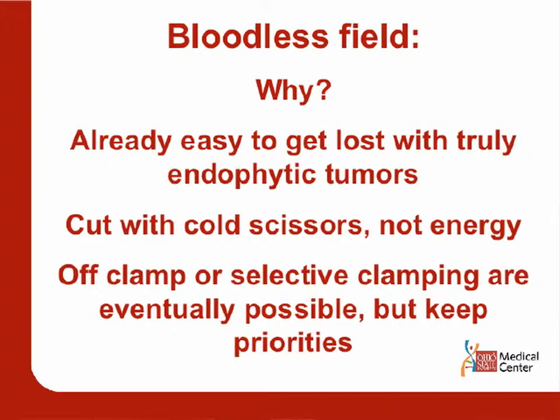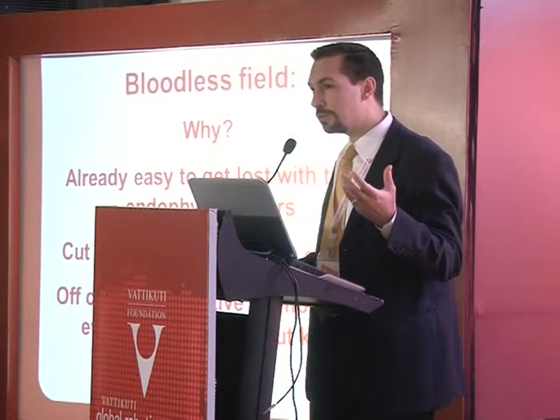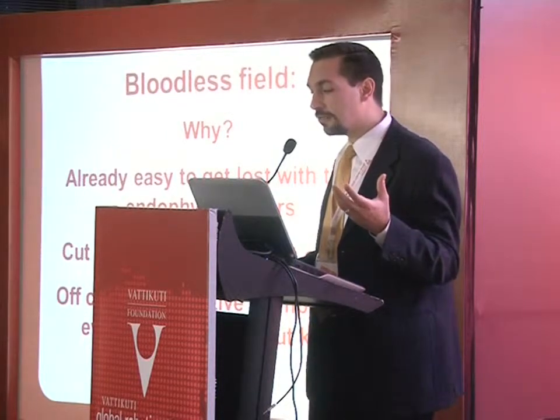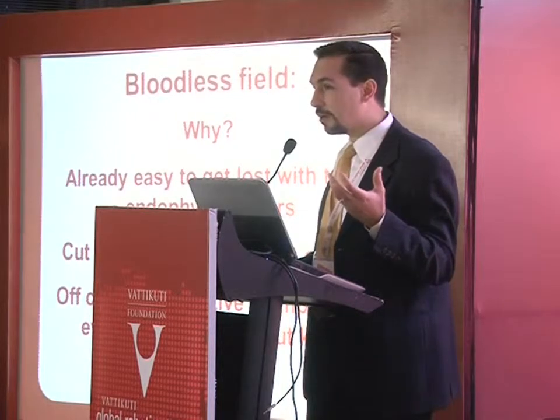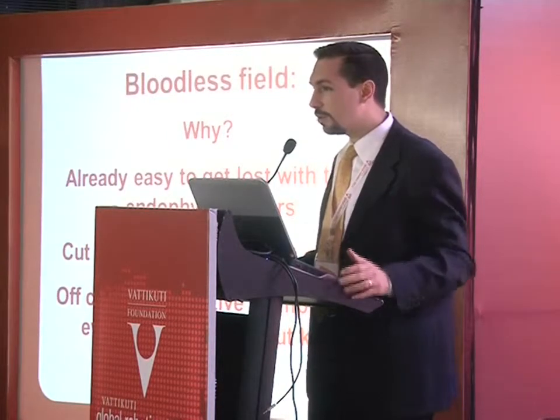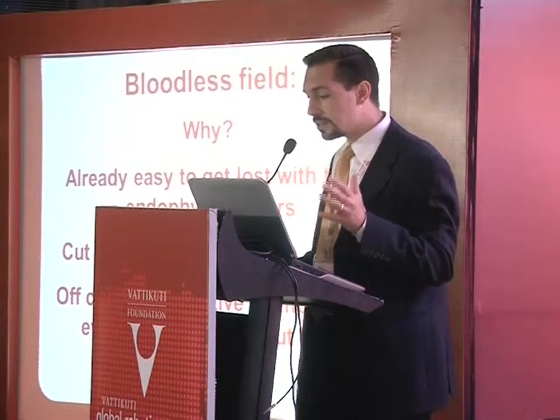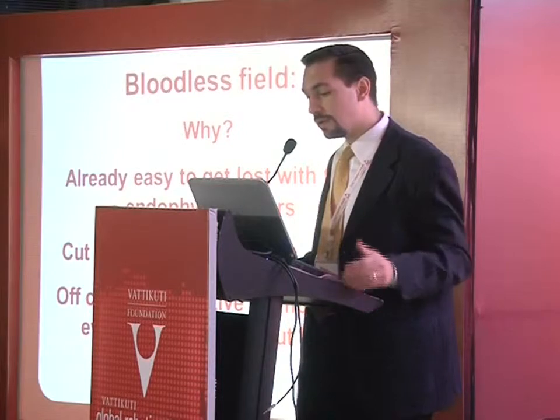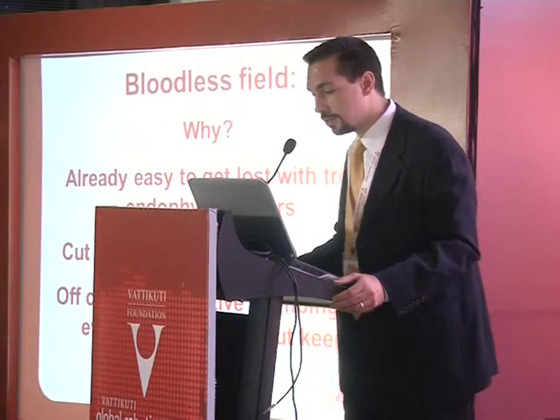It's already very easy to get lost when doing a partial nephrectomy, but that much easier when doing a completely endophytic tumor. You don't have any external cues of the tumor's location — you're purely relying on your ultrasound evaluation and preoperative imaging to know where the tumor is. So if you have a very bloody field, you can get in trouble much more easily. When I do a completely endophytic tumor, I insist on having a bloodless field.